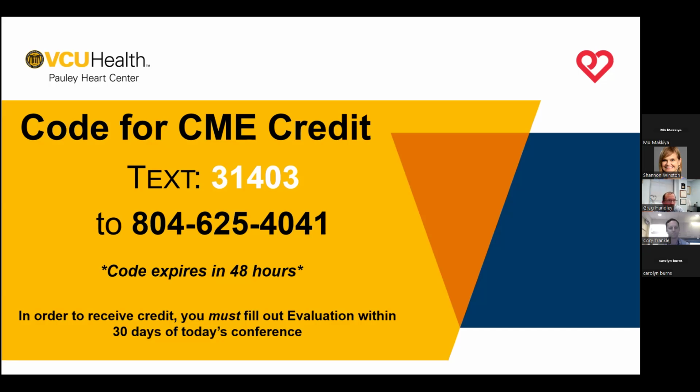You might want to think about these clinical services and creating an acquisition of the atrial volumes and functions in these mitral regurgitant situations, and just looking at the effect of the medical therapy and the procedural therapy on left atrial function, and whether or not some earlier interventions could be helpful in that regard. Just a thought. You guys certainly have the firepower to do that type of thing.